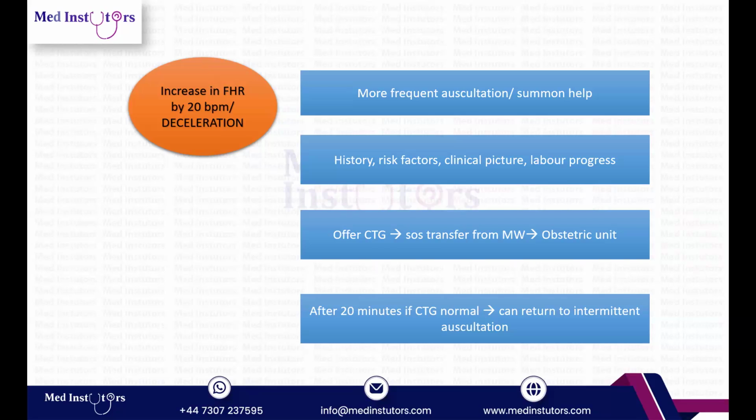Then, after 20 minutes, if the CTG is normal and if there are no additional risk factors, you can offer her to step down and return to intermittent auscultation. However, if the woman declines, you can continue with the continuous CTG.